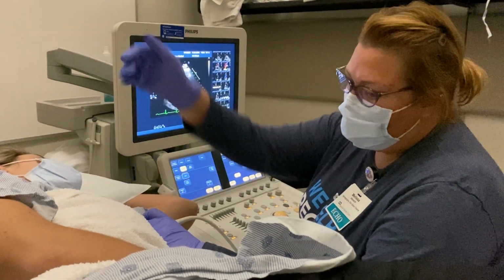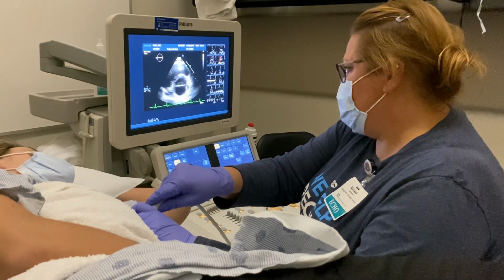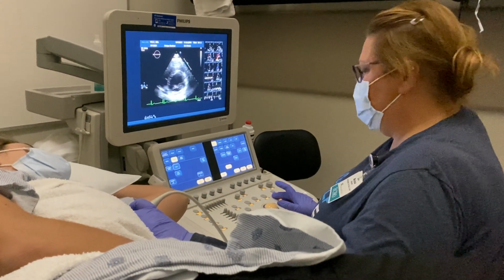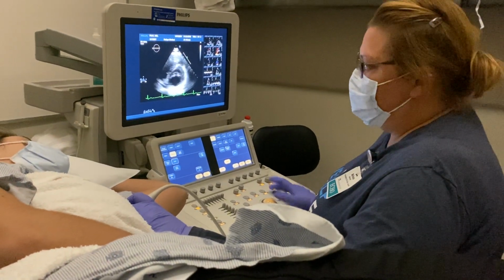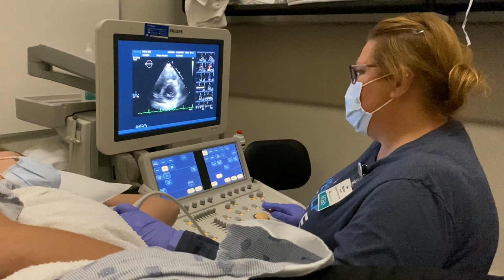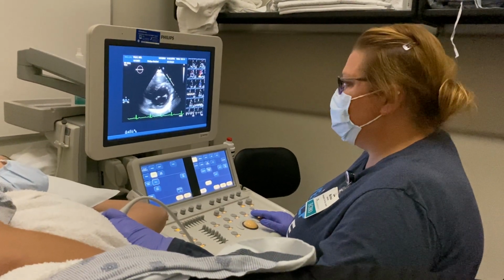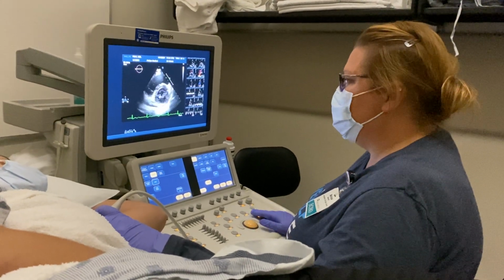So we can get back to her short axis, and instead of tilting up or superior towards the shoulder, we're gonna tilt down to the left hip. Very slowly. This is an in-between view, okay? This means you're not tilted far enough. You only see one leaflet, which is the anterior leaflet. So really what you wanna do is tilt just a little bit more, and now we can see the posterior leaflet.